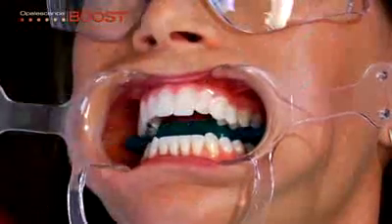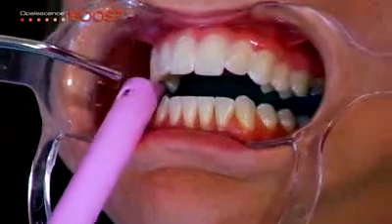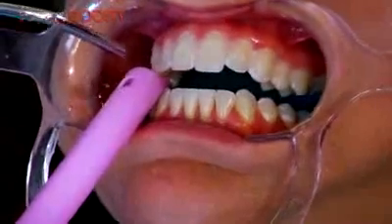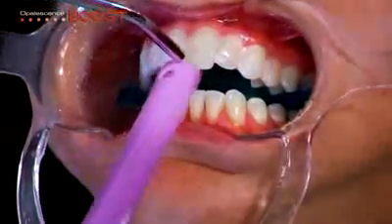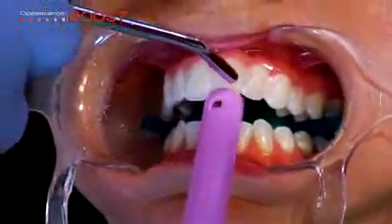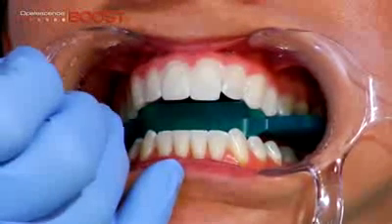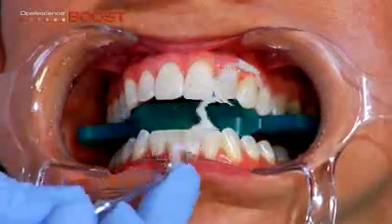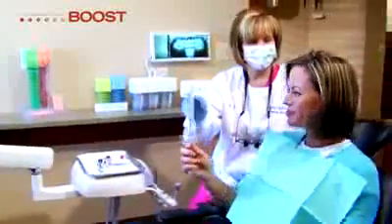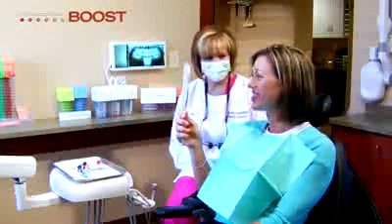After all visible gel is removed, follow with a gentle thorough rinse. Direct the water toward the incisal edge while using high-volume suction. This process may be repeated up to 6 times unless the patient becomes overly sensitive. Evaluate the shade change after each application. The cured Opaldam resin is quickly and easily removed in 1 or a few large pieces. The total procedure typically lasts 60 minutes, with 3 to 4 applications occurring.